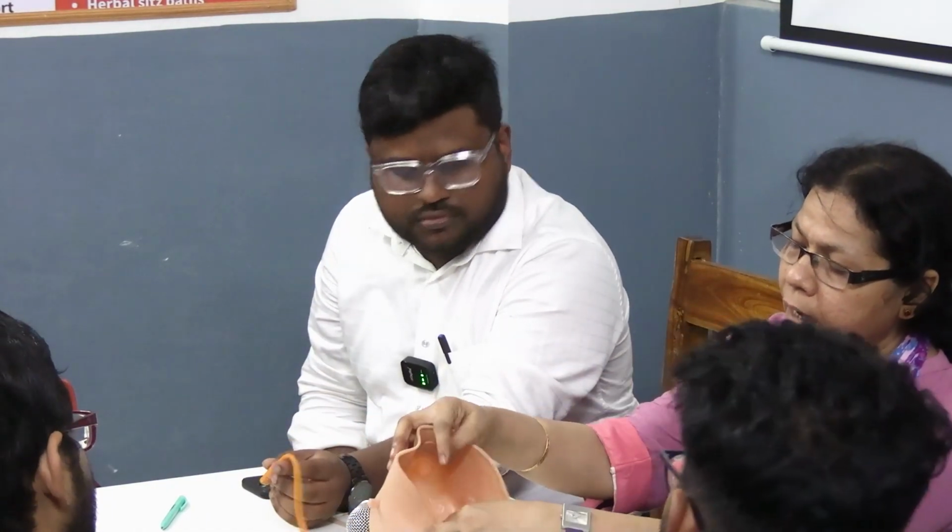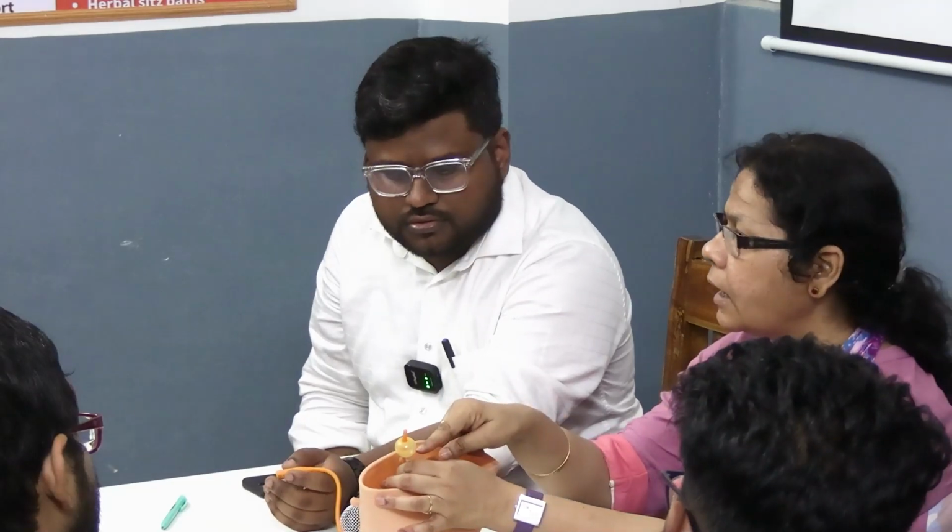How do you know what is the length of the female urethra? At least 4 centimeters. So more than 4 centimeters has to be inside. You should not inflate a catheter in the urethra. What will happen if you inflate this Foley's catheter inside the urethra? Injury, rupture. That was not our intention. Our intention is just to keep it self-retained, so that when you are away, the catheter is in place.